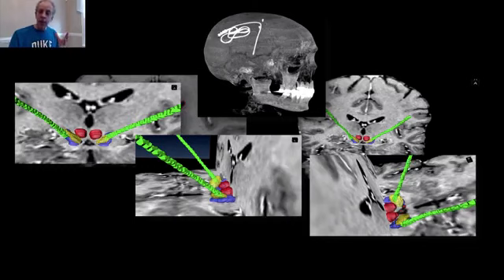These are segmentations that were obtained by active contours type techniques with all these modalities. These are the electrodes. So you register one more modality, which is the CT from after surgery. And then the neurosurgeon can say, looks like I was where I wanted to be. That's great. I actually saw that during surgery because the subject was getting better.